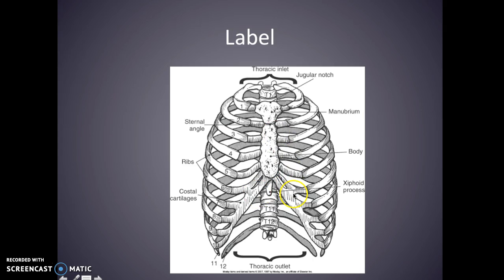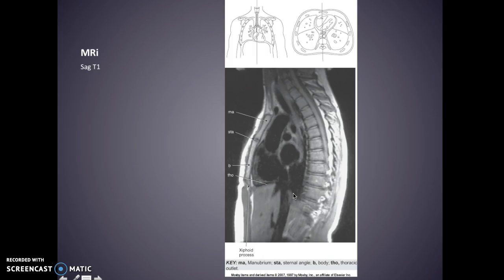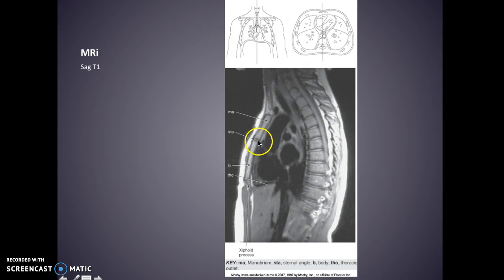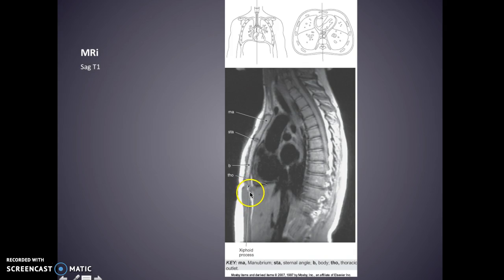Here is a sagittal MRI T1. We have your manubrium and your sternal angle with the body, and at the bottom here is your thoracic outlet and your xiphoid process — you can see just the tip of it there.